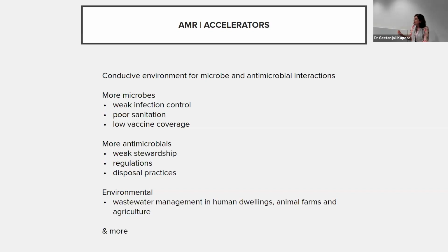Everything is going to take its own 48 hours or 24 hours of incubation because the bacteria take that much time to grow on a culture plate. So all these point of care tests are basically molecular markers and genotypic level testing. Again, that's where a lot of investment is going to be needed to build up those platforms.